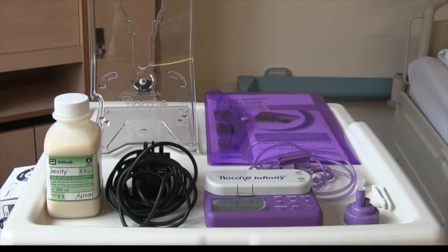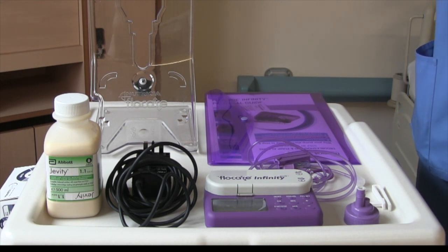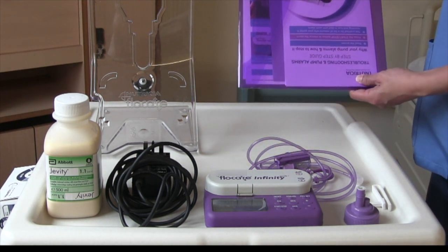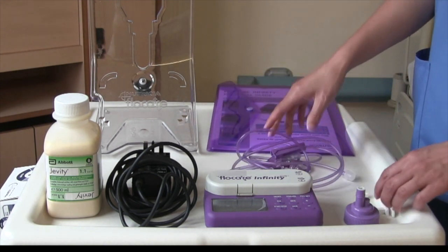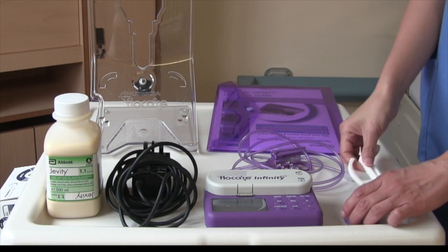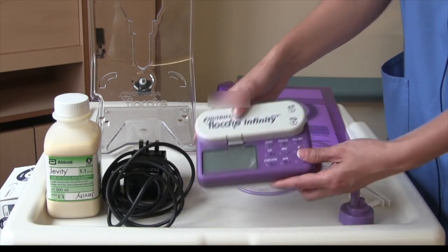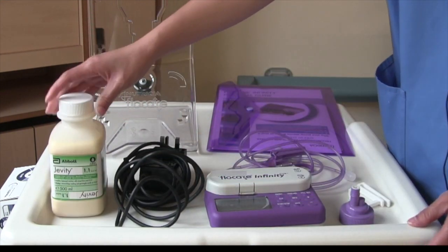This is the training video for the Nutricia Flocare Infinity pump. We'll go over what equipment you'll need, which will be provided by Velindre. You get a training manual and a step-by-step guide on the training pump. You have the giving set, a Z connector which will go onto the stand, the adapter, your feeding pump, the battery pack, and your feed.